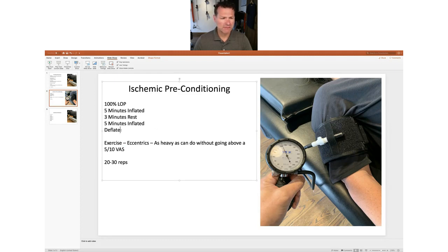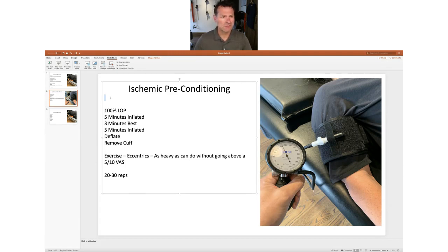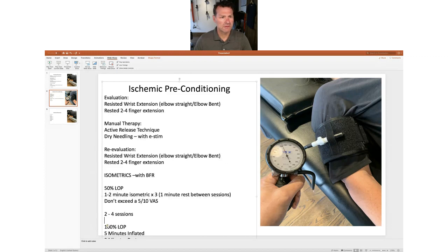So I'm going to totally take the cuff off, and I'm going to just say remove cuff, just so we're clear. And then my exercise eccentrics as heavy as they can do without going above a 5 out of 10. And they're going to do something like 20 to 30 reps. So it's going to be pretty low load. Okay, so the evaluation still is, I'm going to call this, actually, let's call this tendinitis still.